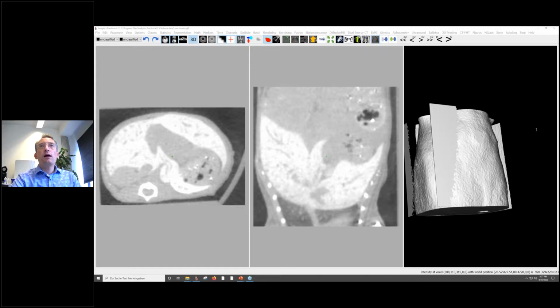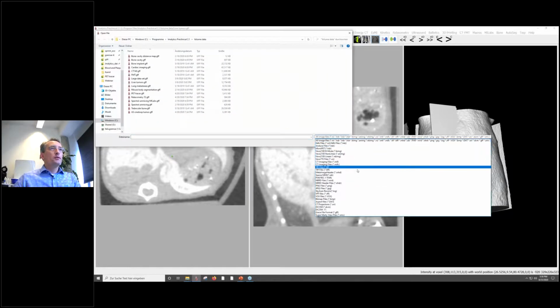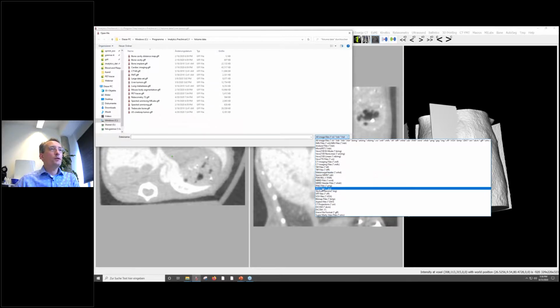What file extensions are compatible with the software? Many, so we can check it here. You can load NIfTI files, Analyze files. These are MicroPET files from the old Siemens Inveon systems, ultrasound files from the VisualSonics systems. These are files from an old MicroCT. You can load TIFF files as stacks, as 3D or 2D TIFFs. MHD files are commonly used, PAR/REC files from MRI and NRRD files are common, PNG files, Skyscan recons, VFF files, VOX files, MEMI files, DICOM files, and we even developed our own file format, the GRACE file format.